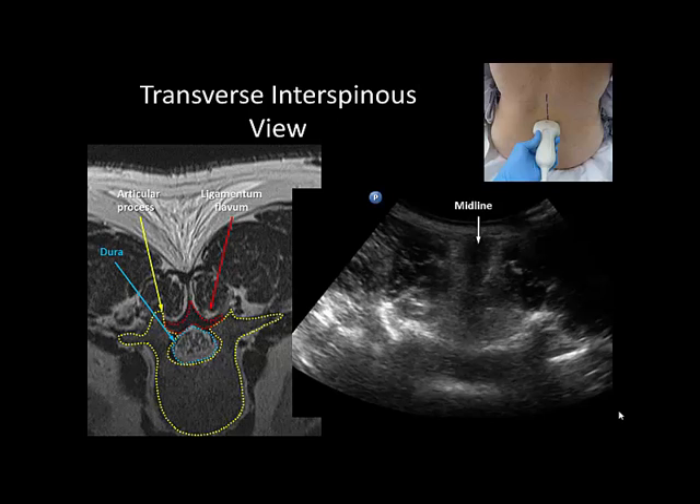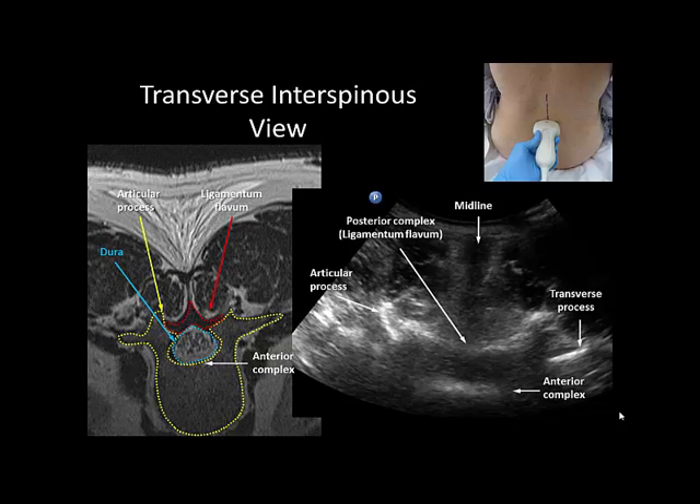In patients with good sonoanatomy, this is recognizable by the hyperechoic lines of the posterior complex and anterior complex. The posterior complex represents the ligamentum flavum and posterior dura, and is usually at the level of the base of the articular process. The anterior complex represents the anterior dura, posterior longitudinal ligament, and vertebral body, usually at the level of or slightly below the transverse process.